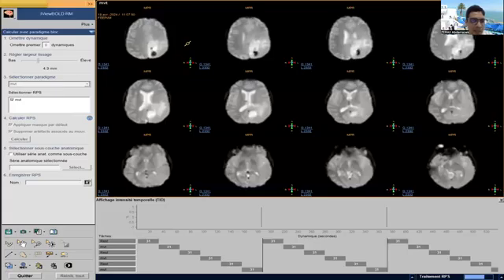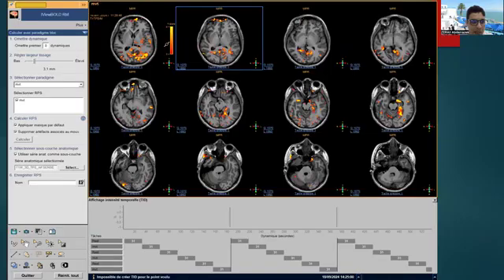So this is the post-processing inside the IViewBOLD. Here is the image that we have, with the different paradigm phases, rest, motion, rest, motion, rest, motion, over different times. Here we can select the paradigm. I have a video after this slide that talks about the post-processing. Maybe we use the anatomical series, like here a 3D T1 turbo field echo reference with SENSE, to see the different activations in different areas.